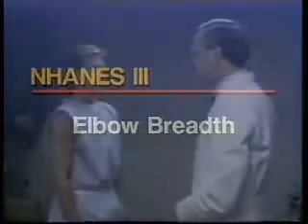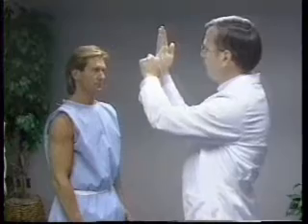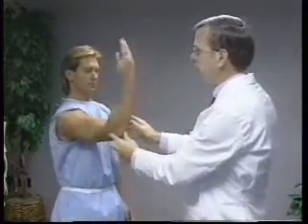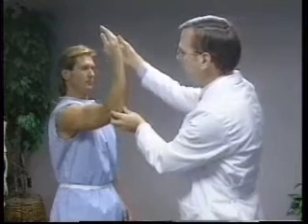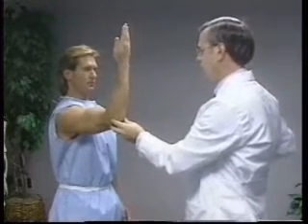For elbow breadth, the subject stands facing the technician. The right arm is extended forward and is flexed so the upper arm and forearm form a 90-degree angle at the elbow. The fingers point up, with the posterior part of the wrist toward the technician.